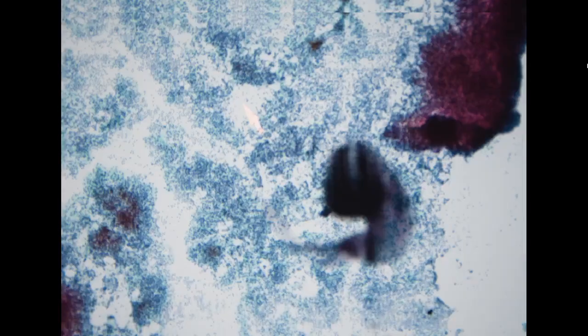So next specimen, also lung cancer. We have a lot of this type of specimen. History of lung cancer, low power. It was not as striking as the prior specimen, but just on low power, you can still identify tight clusters, darker staining, and bigger cells, three-dimensional architecture. So we just need to go to high power to confirm.